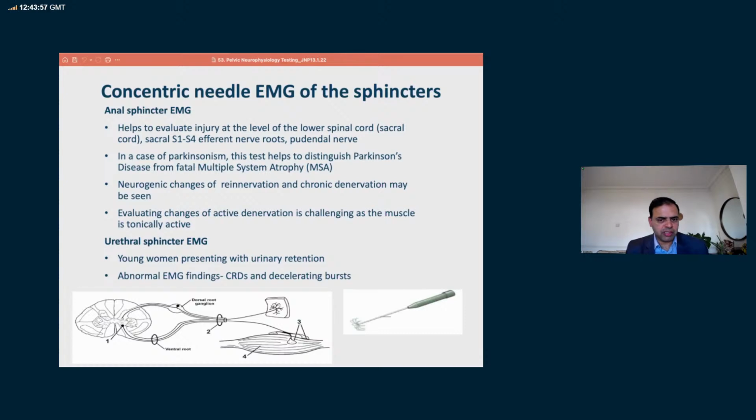Now, we heard about surface EMGs earlier. With concentric needle EMGs, it is specifically into a muscle, and hence there's no noise from the pelvic floor. You can study specifically from the individual muscles, and as it was pointed out in a Q&A session, it's a quantitative EMG in contrast to a kinesiological EMG, which is a qualitative EMG recording. And of course, once again, the purposes of these are different, because concentric needle EMG is more in regards to diagnostics, if there is damage to the innervation to that muscle.